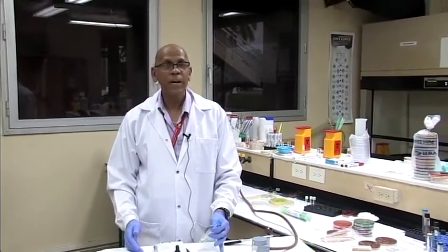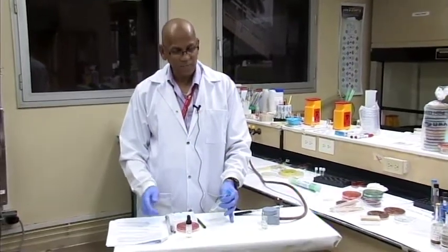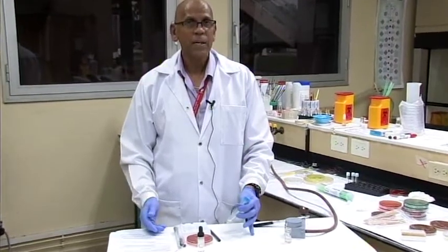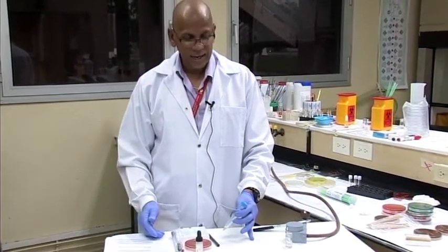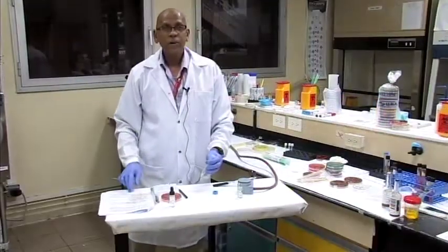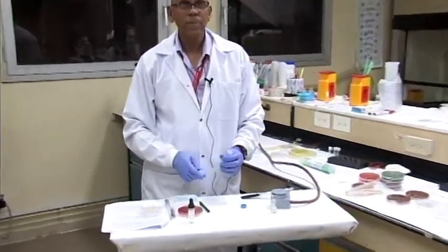One form of wet preparation involves doing that test for a urinalysis where we look at the sediment under the microscope. So you would pour some urine sample in this tube, centrifuge it for 5 minutes at 1500 Gs, and then look at the sediment under the microscope. So for urines, we will have sediment here where we're going to do a wet preparation of it.